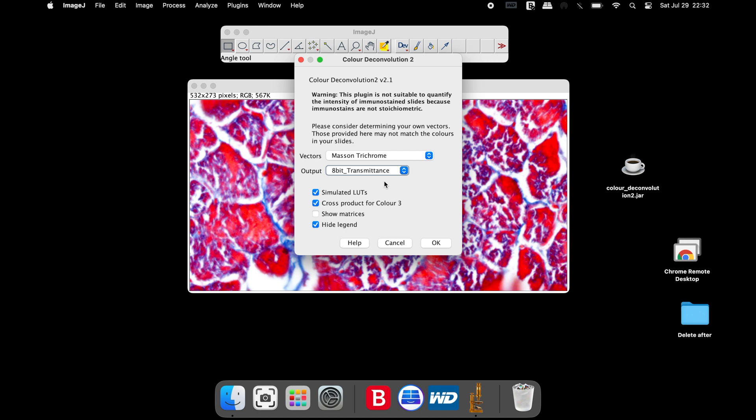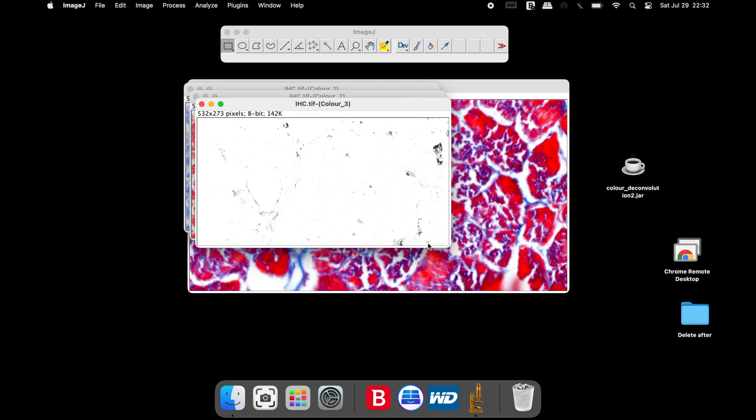Select the options Simulated LUTs, Cross Product for Color 3, and Hide Legend. Once all the parameters are set, click OK.